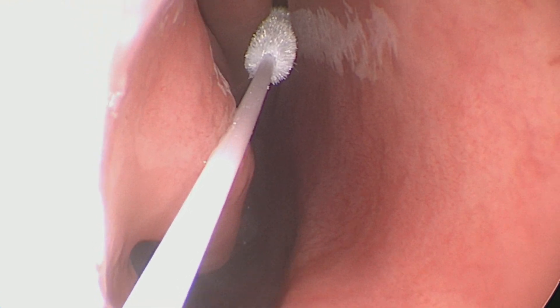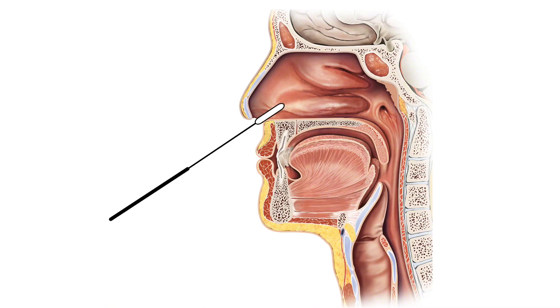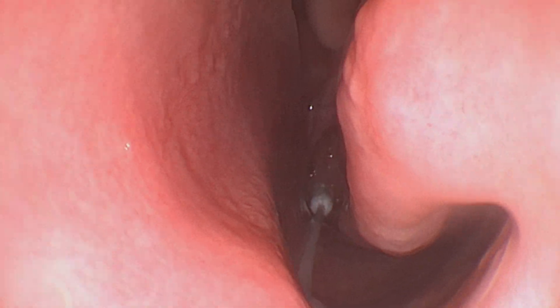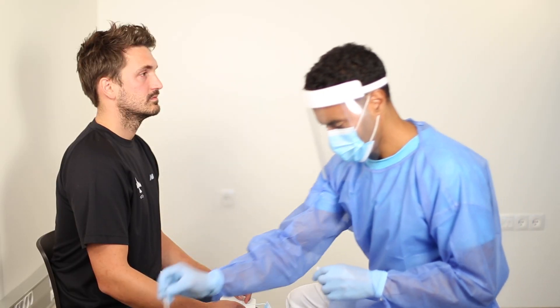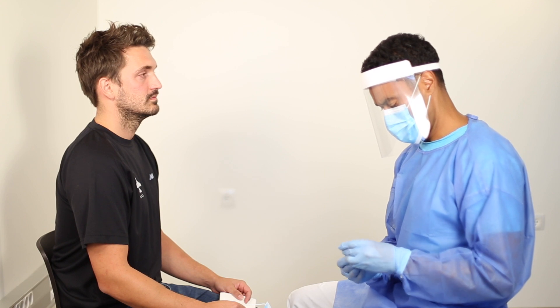It is a common mistake to point the swab too much upward toward the turbinates. If resistance is met prior to expected, the swab should be withdrawn and a new attempt is made to insert the swab with the direction changed down towards the earlobe. If unsuccessful, try the other nostril. Place the tip of the swab into the vial and aseptically break the shaft at the marked weak point. Throw the shaft in the bag for hazardous waste and tighten the screw cap firmly.